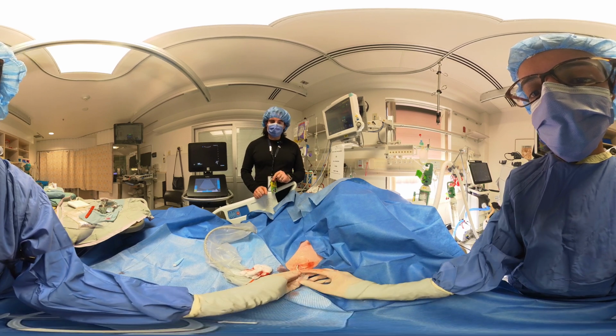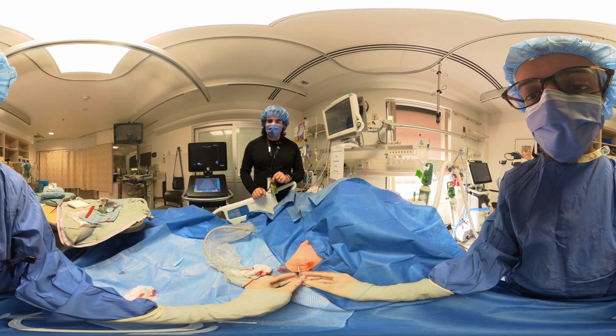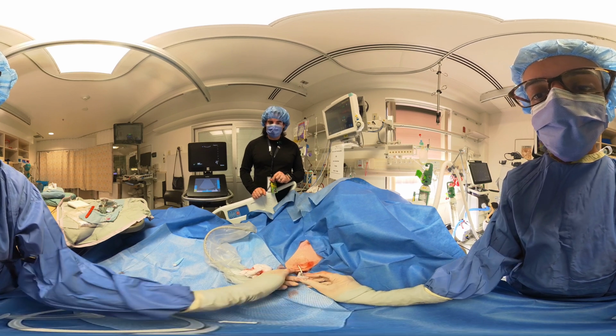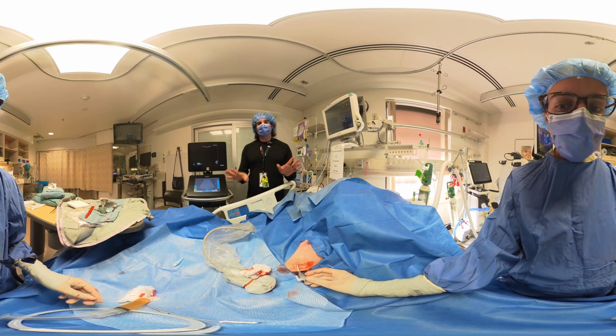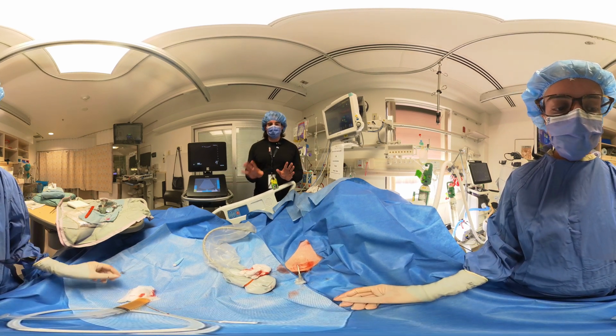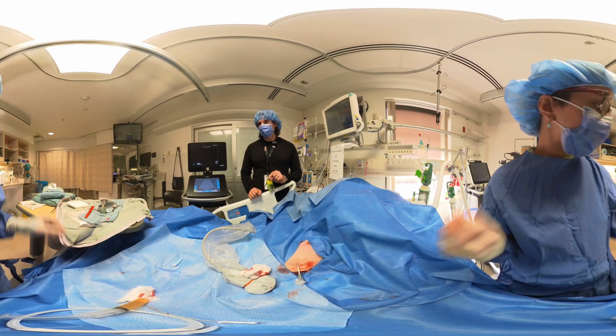Now that it's on, we're going to turn the little lever towards the patient. Okay, that means it's off towards the patient. Correct. Turn forward. Yeah, this gives us time. Now it's isolated. It's not going to entrain air. Now we can suture in the device. Okay, so let's suture in the tube now.